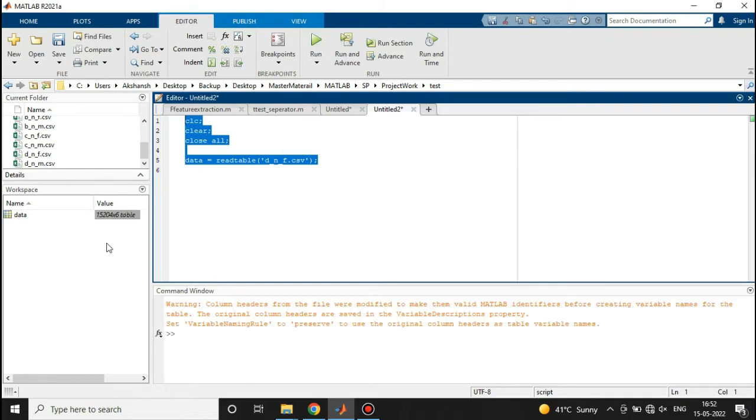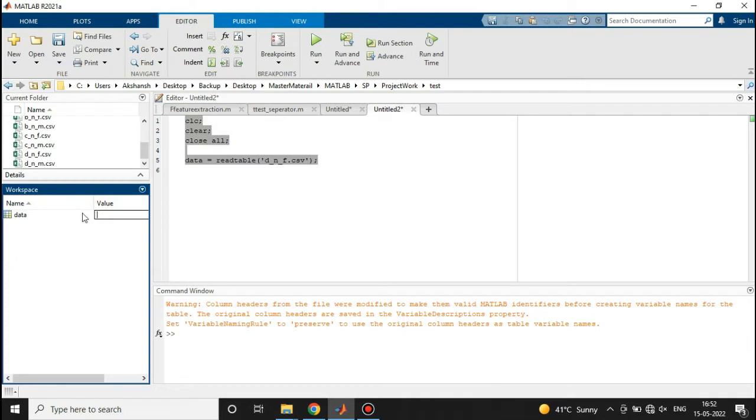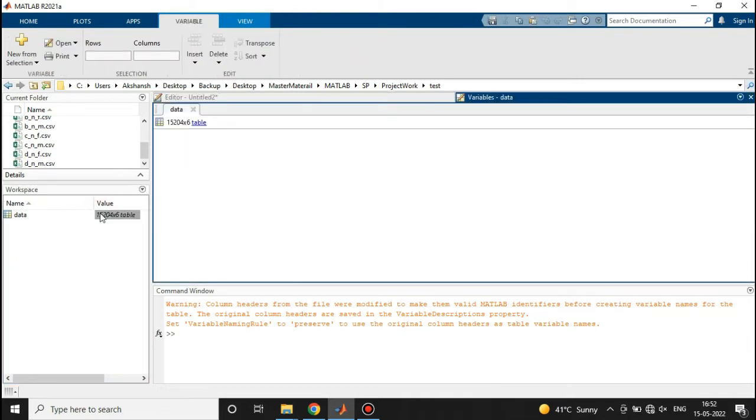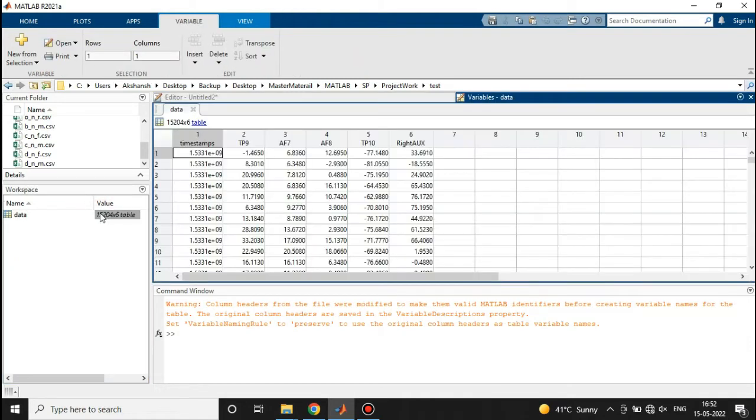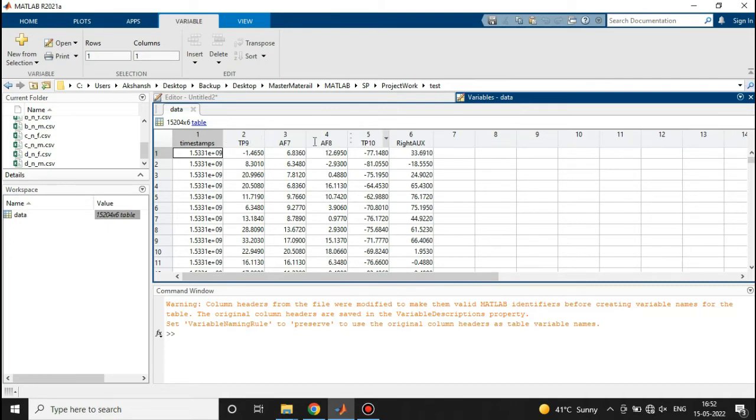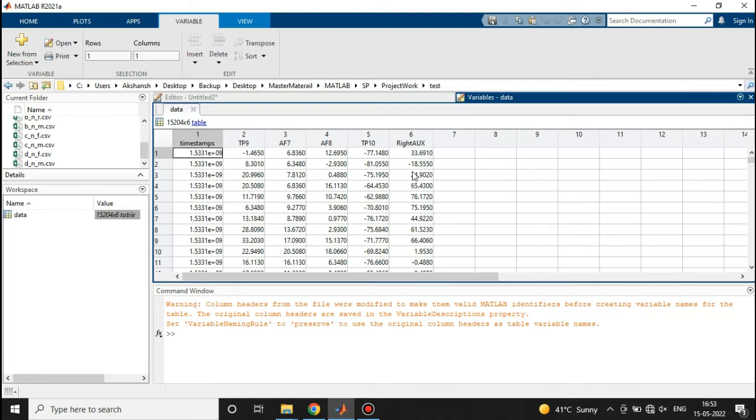So here you can see that the data is right here. When I show you this data, you can see that this one is the timestamps, this is TP9, AF7, AF8, and TP10. These four are the electrodes that are reading the brain signal from particular locations. The sixth one is Right AUX, which is basically noise only. We are going to ignore the first column and this sixth column. The EEG signal streams that we have are TP9, AF7, AF8, and TP10.